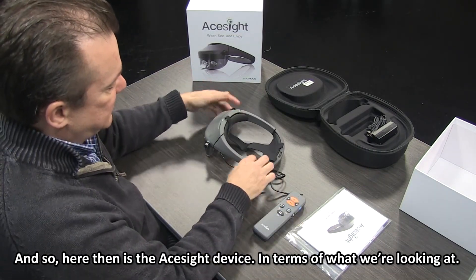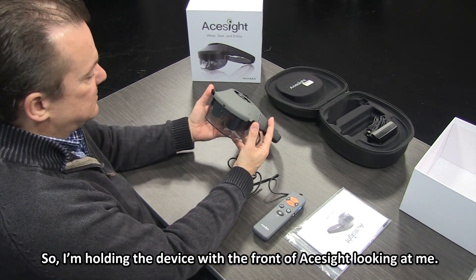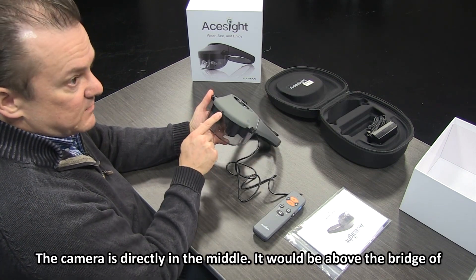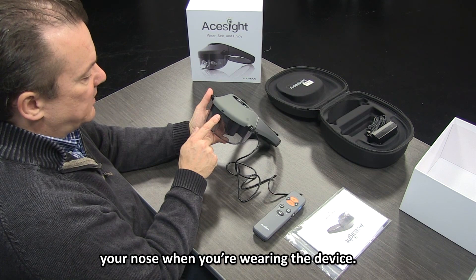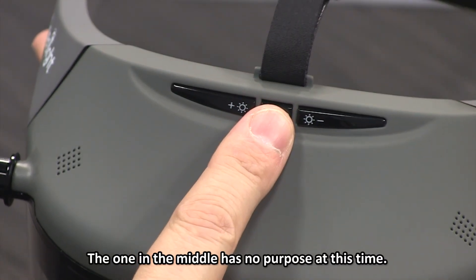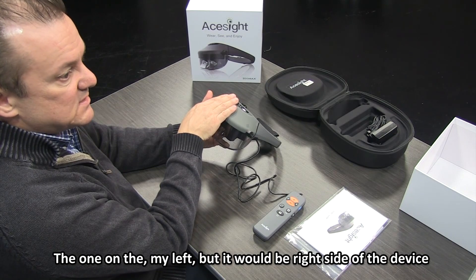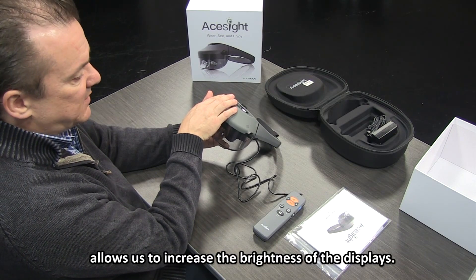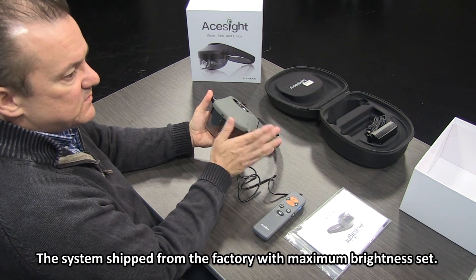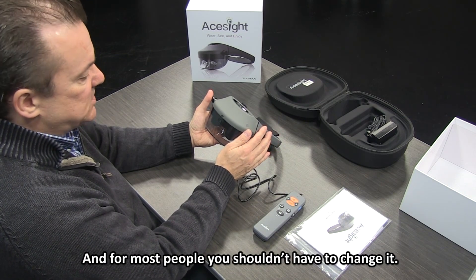Here is the ACE Sight device. I'm holding the device with the front facing me. The camera is directly in the middle — it would be above the bridge of your nose when you're wearing the device. There are some buttons along the top. The one in the middle has no purpose at this time. The button on the right allows us to increase brightness; the one on the left will dim it. The system ships from the factory with maximum brightness set, and for most people you shouldn't have to change it.